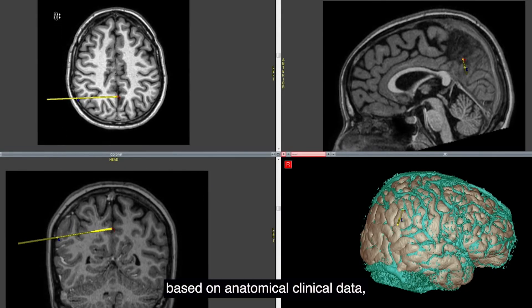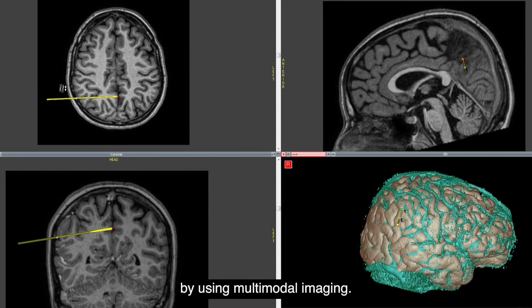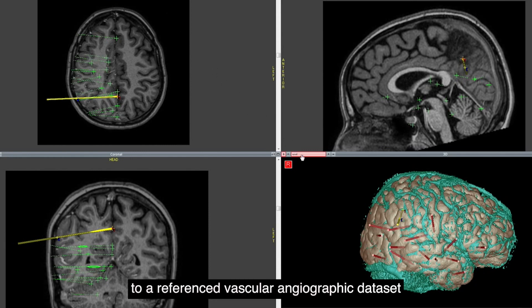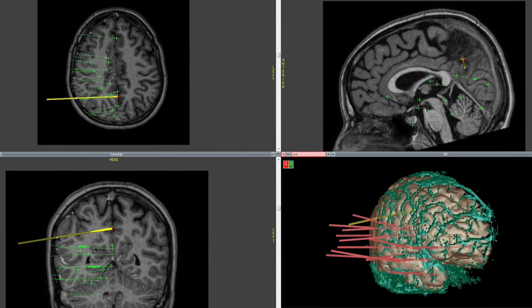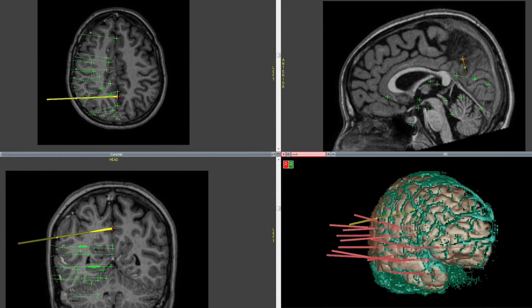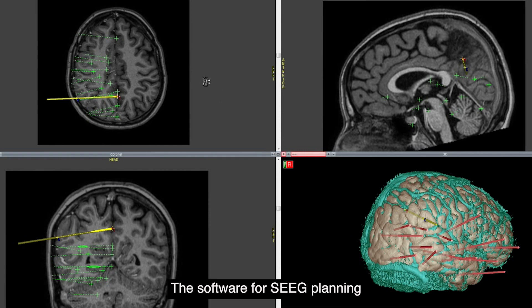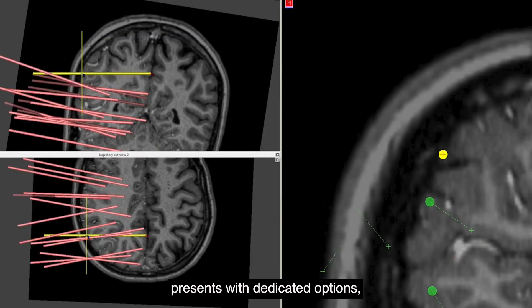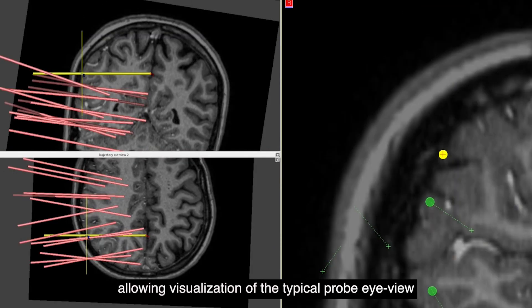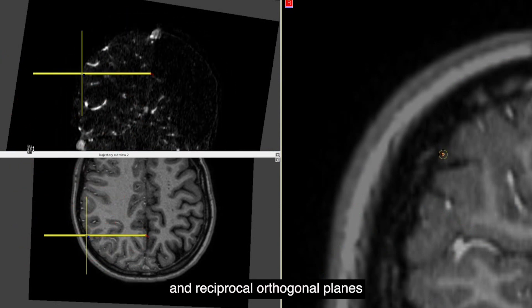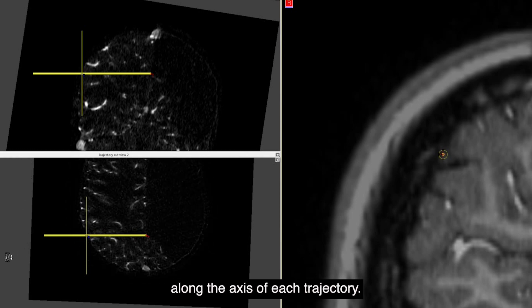SEEG is planned based on anatomic electroclinical data by using multimodal imaging. Desired datasets are co-registered to a reference vascular angiographic dataset acquired by using O-arm. The software for SEEG planning presents dedicated options allowing visualization of the typical probe's eye-view to explore the trajectory along the x-axis and reciprocal orthogonal planes along the axis of each trajectory.